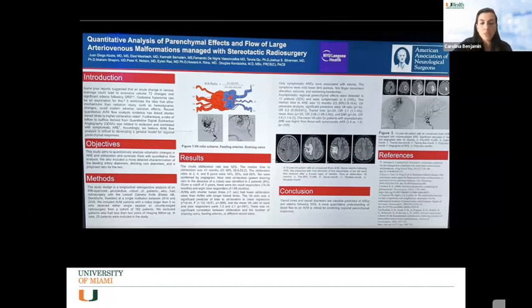It is important to know that while we do see this T2 signal change with edema, and you can see some of these photos here showing T2 signal change in the brain, that doesn't necessarily correlate to a neurologic deficit, but it often can, and it can lead to seizures, neurologic deficit, headaches, hemorrhage. So it's important to differentiate between a radiographic effect, which we're seeing pretty frequently, and a true adverse reaction where the patient requires corticosteroid treatment and possibly even Avastin for radiation necrosis effects, for example, in a patient like this.